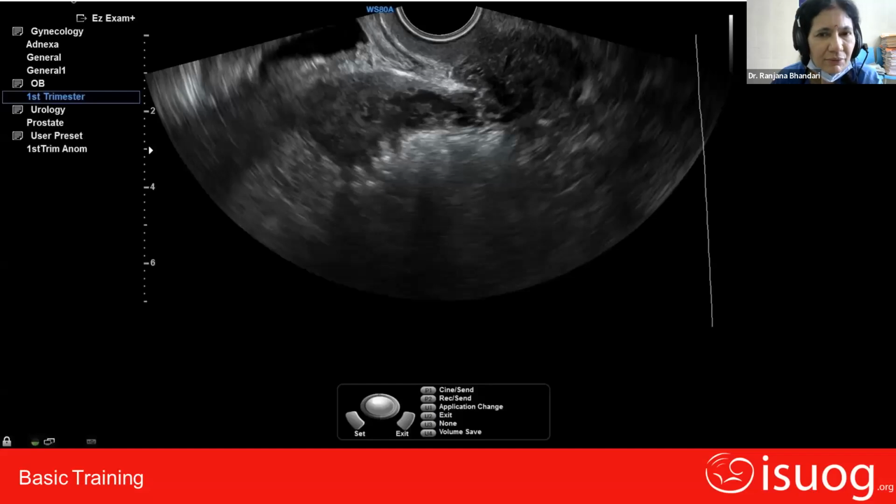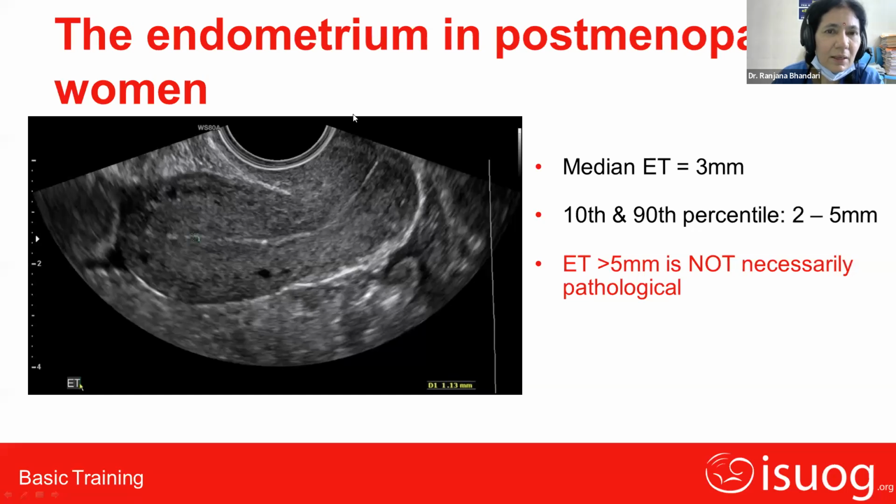So this is another video in which again we are showing how the endometrial thickness is measured. So now the endometrium in postmenopausal women. It is under the influence of estradiol and progesterone, and as we know, estradiol and progesterone decrease a lot in postmenopausal women.